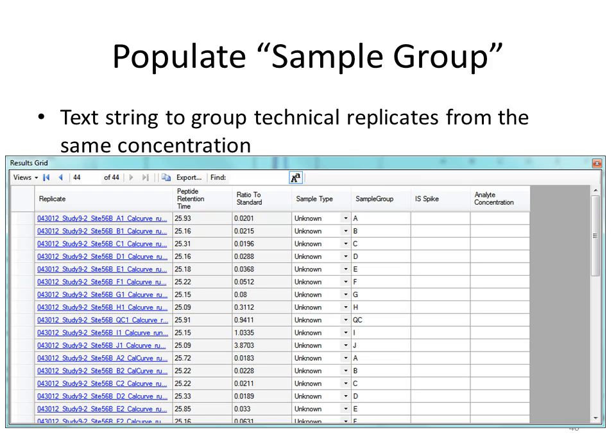And it's an alphanumeric string, so if you put in concentrations all in the same units, like 0.1 and 1.0 and 10, it sorts them not in numerical order. So I always go with text, and I usually label them A through whatever. Now, please make sure you note the QC that I have in the middle. That is not a standard. That's not a calibration curve standard. And so you can label it as QC.